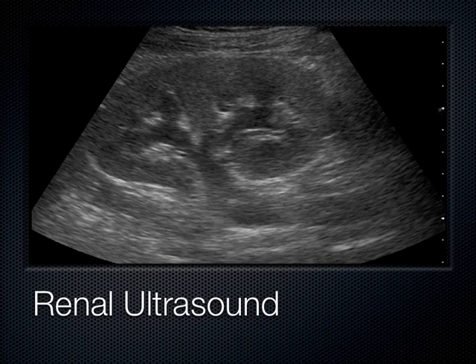So that thick capsule is out here. This is all the cortex of the kidney here. We can see the cortex all the way around here. And this is the sinus or pelvis of the kidney, this hypoechoic or anechoic area. Recall that hyperechoic means bright, hypoechoic means dark, and anechoic means black.